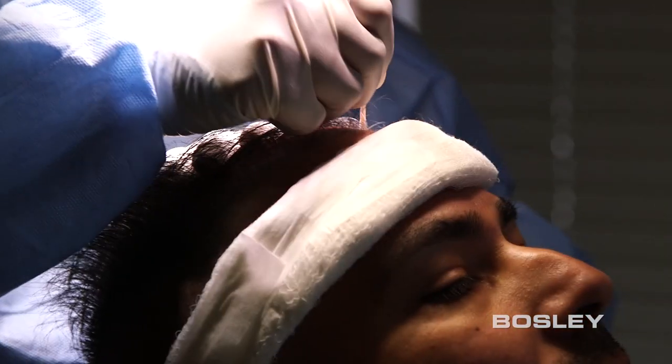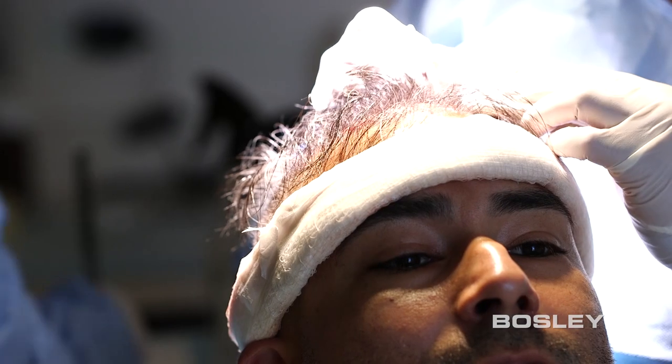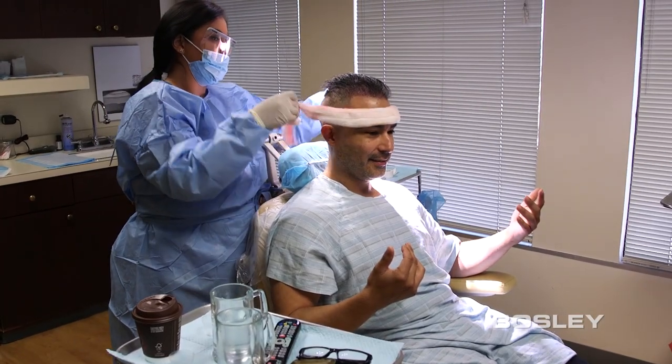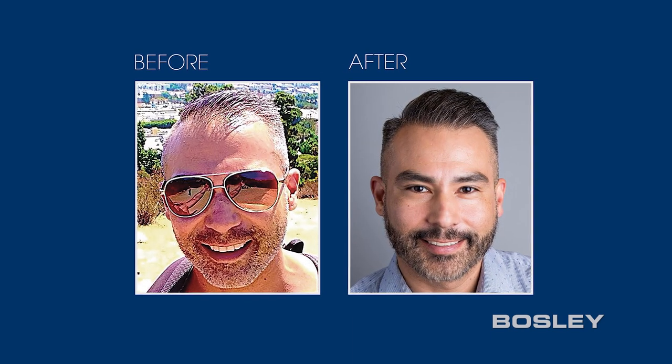We begin by filling in the new hairline, and then continue by adding more density throughout. By cherry-picking the perfect follicles for their specific need, we ensure a natural-looking hairline. That's the benefit of this procedure.